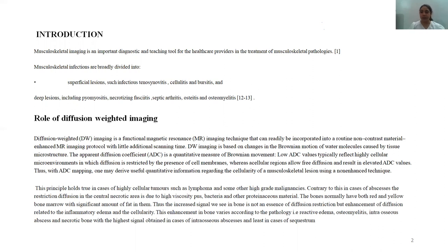Low ADC value typically reflects highly cellular microenvironments in which diffusion is restricted by cell membranes, whereas acellular regions allow free diffusion and result in elevated ADC values. Thus, ADC mapping provides useful quantitative information regarding cellularity of musculoskeletal lesions using a non-enhanced technique. This principle holds true in highly cellular tumors such as lymphomas and other high-grade malignancies. Contrary to this, restricted diffusion in the central necrotic area of abscesses is due to high viscosity of pus, bacteria, and other proteinaceous materials.